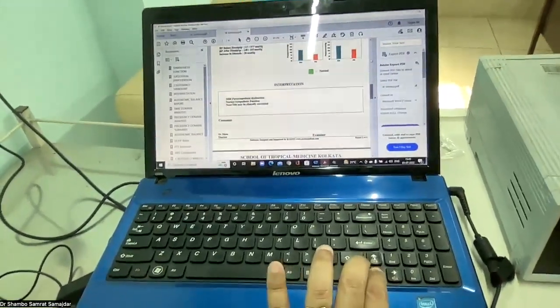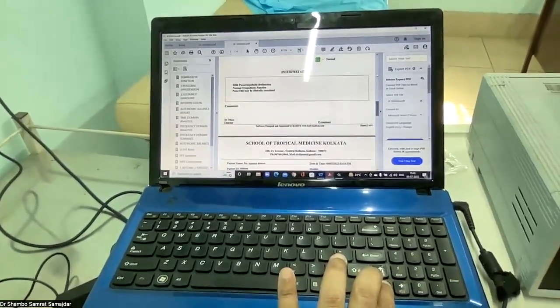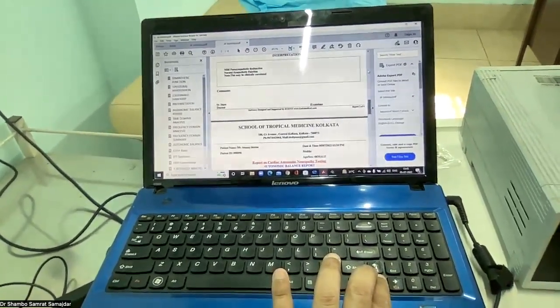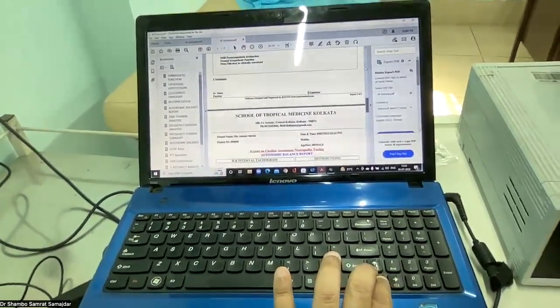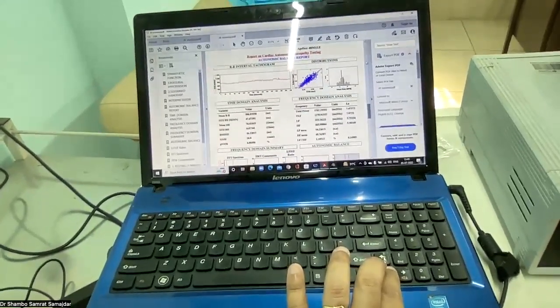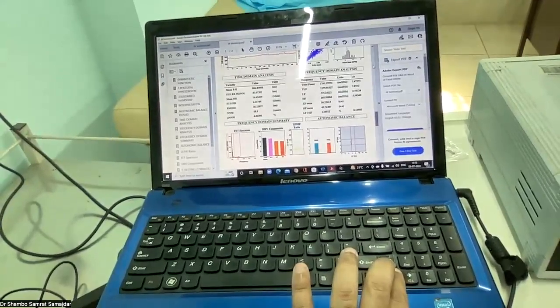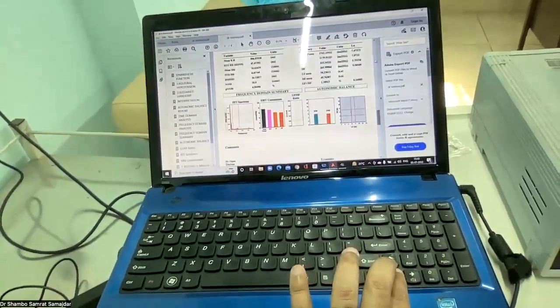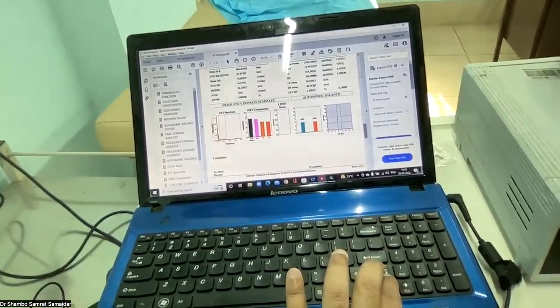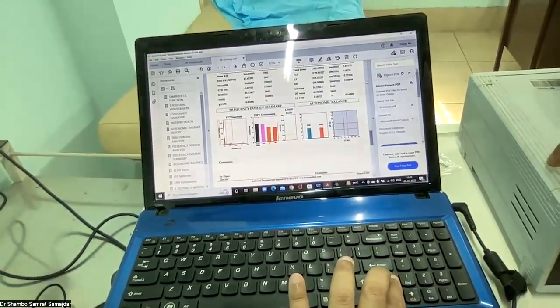So here the machine is interpreting like mild parasympathetic dysfunction, but as we had already mentioned, maybe due to that timing, the breathing in and breathing out time differences, we need to interpret it after proper clinical correlation. Now coming to this RR interval tachogram, this is a complicated area where we need to apply much more things on physics and some core physiology and mathematics. So here what we want to appreciate is that the LF/HF ratio is a little bit on the lower side, but not that much lower compared to the normal one.